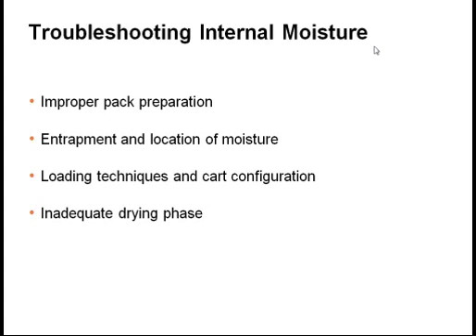Do not check the interior of the sets until they have been cooled. If not cooled properly, the instrument sets will feel moist. When the sets have cooled and the towels feel wet or moist, this is an indication of a wet pack problem. Another area of concern includes overloaded instrument sets creating condensate which cannot be revaporized.